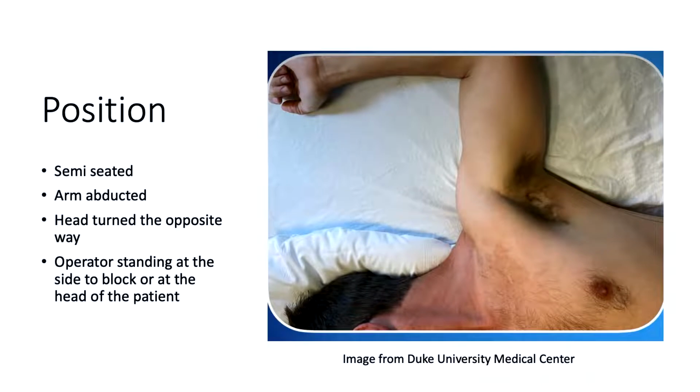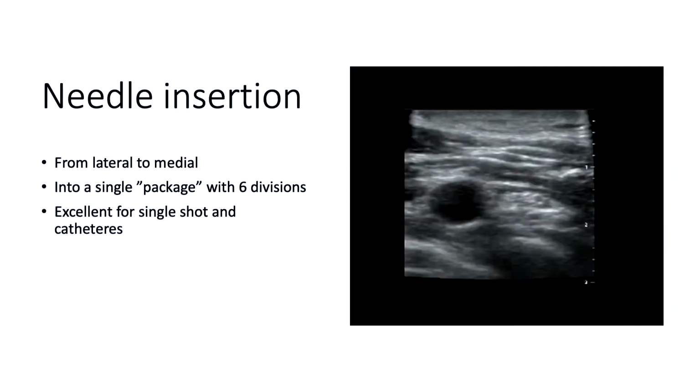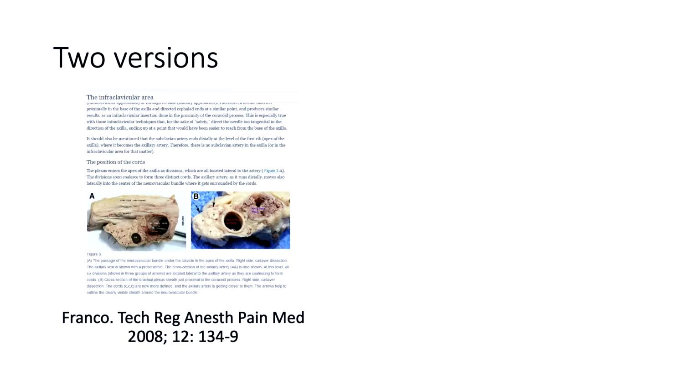So the needle insertion would usually be from lateral to medial, but you could do it out of plane. This is one of the blocks where out of plane would have an advantage, but we don't have time to go over that. So, needle insertion and injection into that.